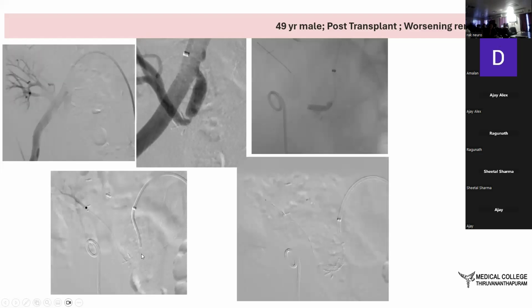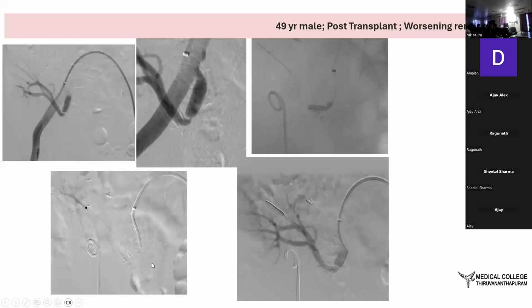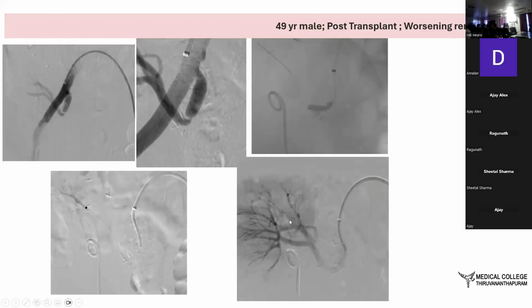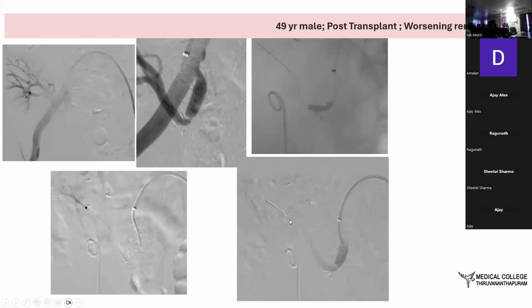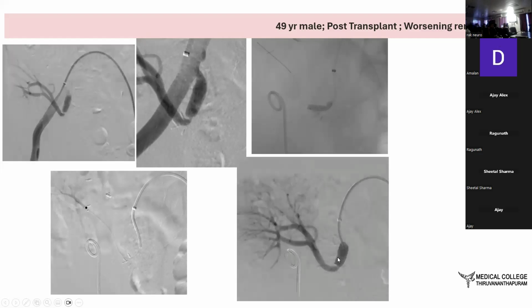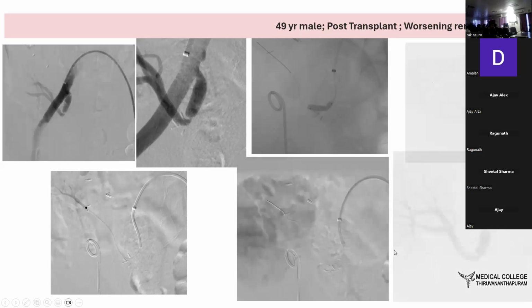But the issue is that these are likely to recur, and true to the fact, around 4 weeks later the deterioration of renal function and output occurred again, and as a second sitting we had to stent the patient. The patient is now on antiplatelet therapy.